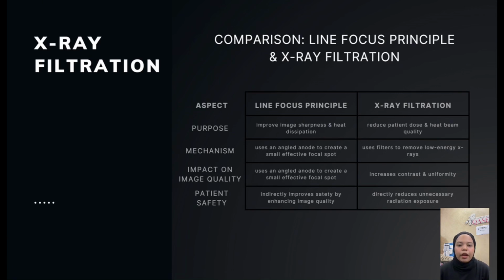For the impact on image quality, the line focus principle enhances the spatial resolution, and X-ray filtration increases the contrast and uniformity. Last but not least, for patient safety, the line focus principle indirectly improves safety by enhancing the image quality, while X-ray filtration directly reduces unnecessary radiation exposure.